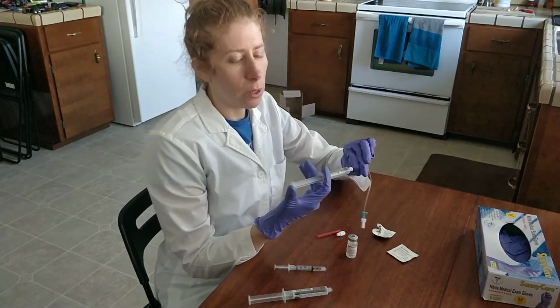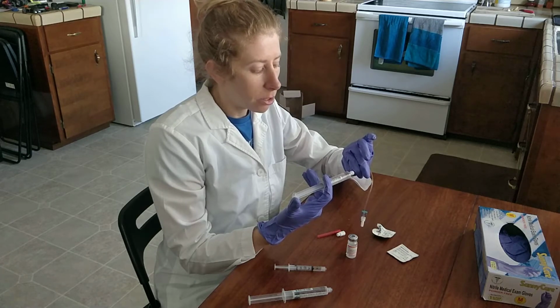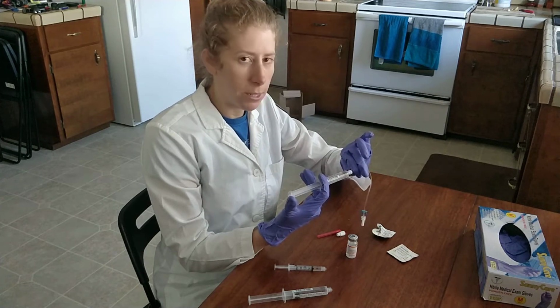Then I'm going to slowly push 5 milliliters of normal saline into the line. I'll start the first 2 milliliters at the same rate as the medication that I pushed until it clears the line. Then I can increase the speed a bit, but I want to continue slowly.